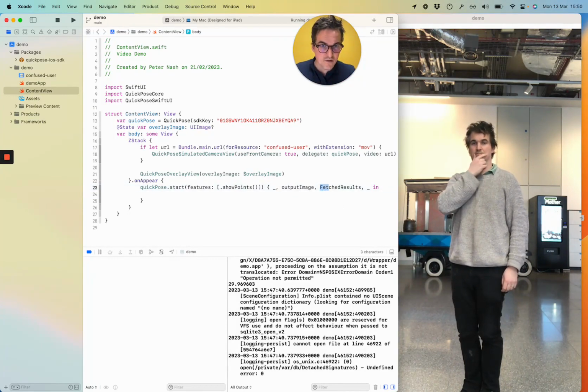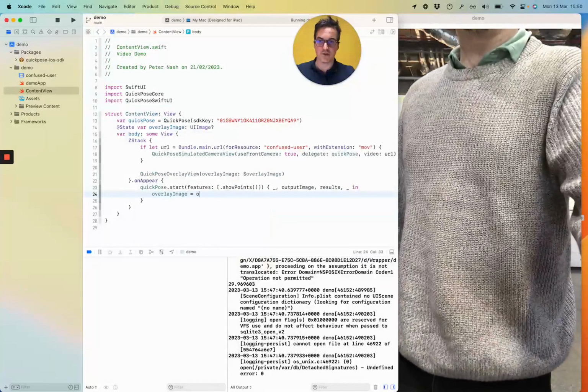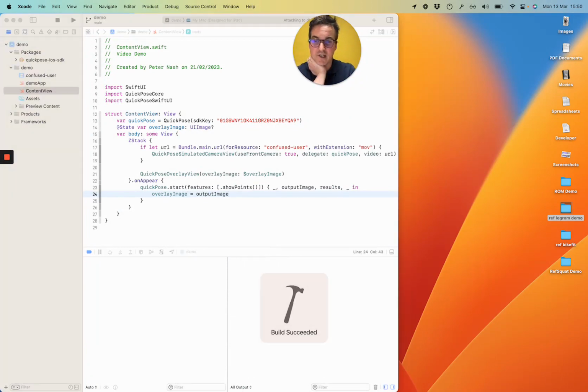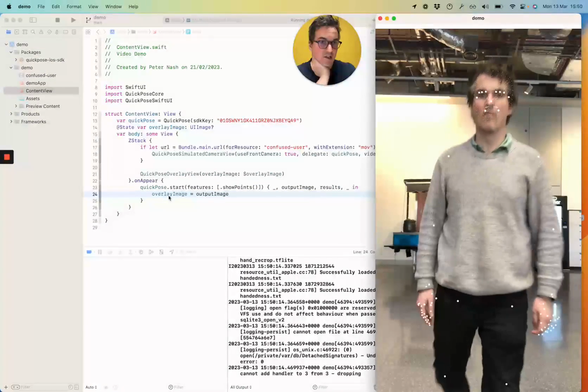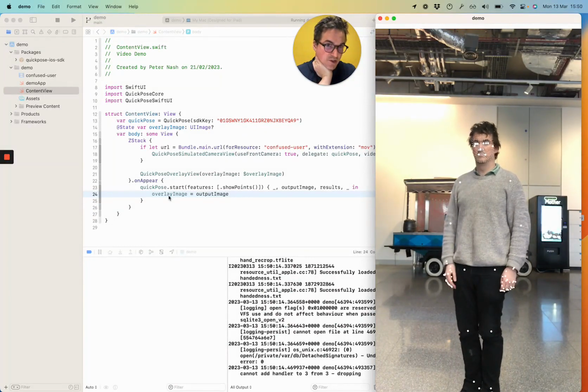Don't remember calling that finish results. Cool. Okay, so now we want to set the overlay image to the output image. So this is just our basic boilerplate, nothing too exciting yet. What I'm expecting is for my face to have a load of dots on it. Great. It's pretty responsive as well, which is nice to see.